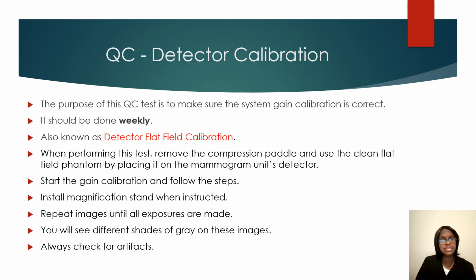Okay, for the QC detector calibration, the purpose of this test is to check the system gain and calibration and make sure that it is correct. It should be done weekly. This is also known as the detector flat field calibration.